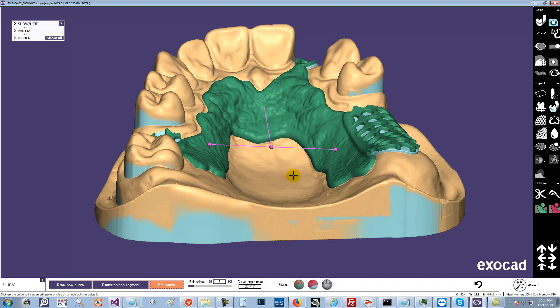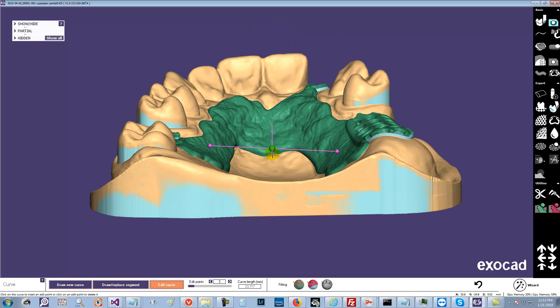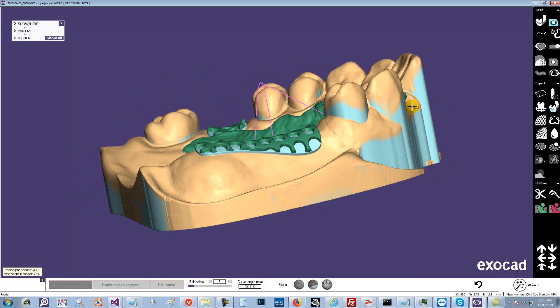The first trick is holding down the Shift key. So if you hold down the Shift key while you're dragging, it will basically drag it on the screen as opposed to fitting it on the model. So the point does not fit on the model.